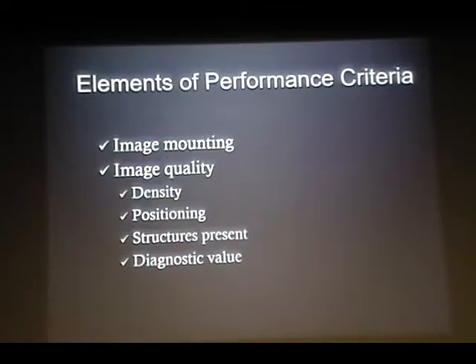Density is basically the amount of black and white that you can see on a radiograph. So that's like contrast? Yes. Oh, contrast, again, density is different, contrast is different when you are using it in radiology. Contrast is the number of grayscales that you are going to see. For instance, are you an Apple user by any chance? No. Okay.